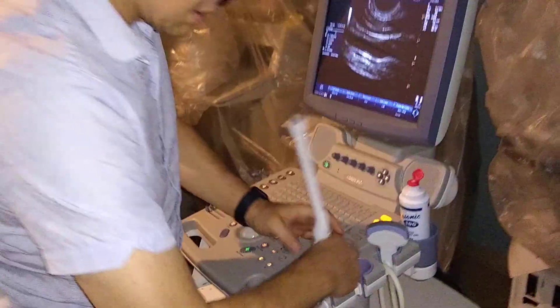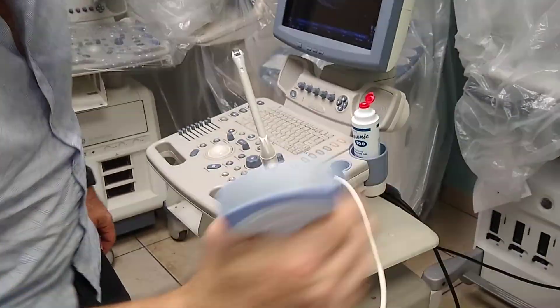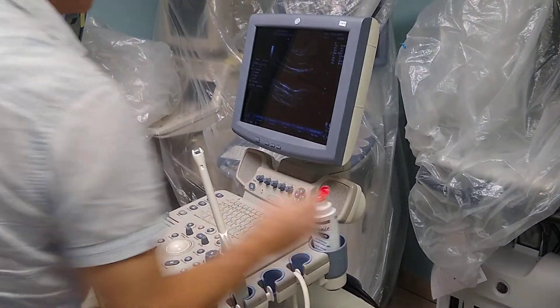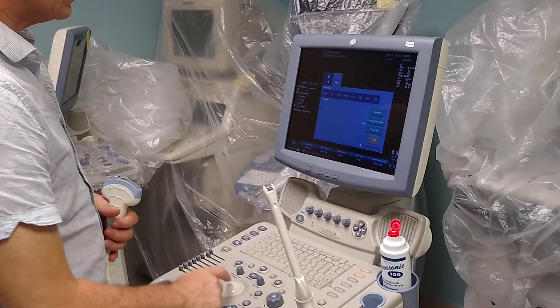Now let's try the other one, which is the convex. This convex is in pretty good condition — this is the 15843. I am going to take some of the gel from here. I change the probe for the 4C.